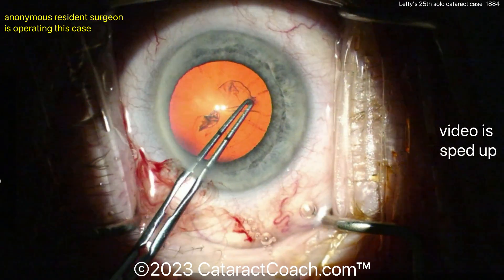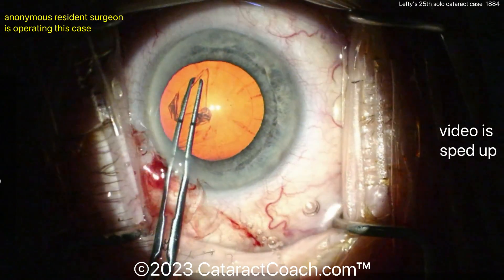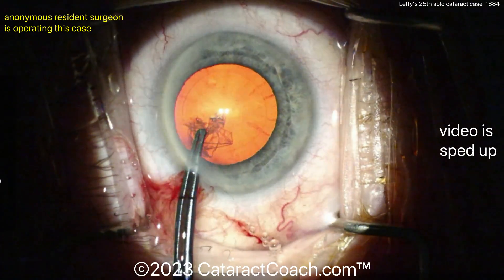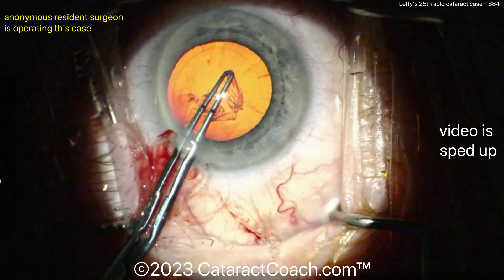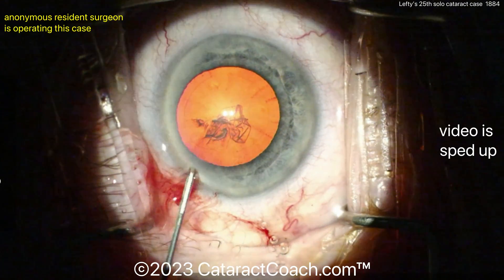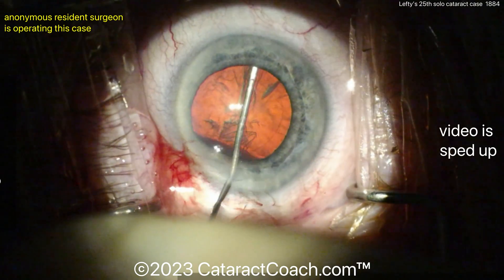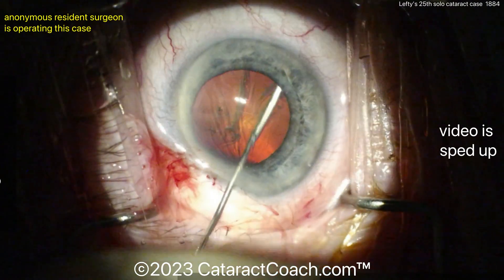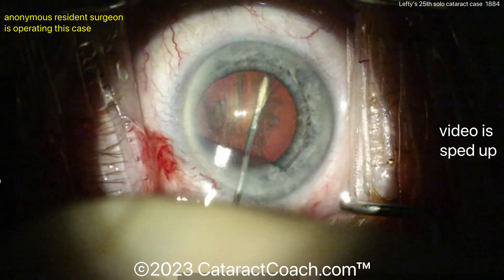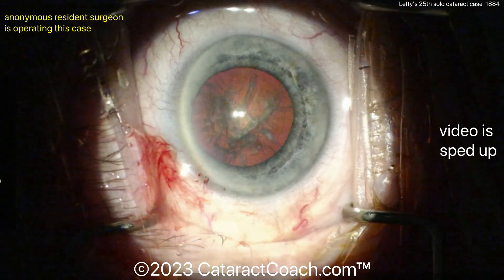Here's the capsule being done. I like the forceps that are marked off, similar to mine. This is pretty good for 25 cases in — that's a nice-looking rhexis. That is very good; I would have guessed this is at least a few hundred cases in. Fantastic job on that rhexis. Incision looking pretty good too. I like how the limbal vessels were barely nicked. Let's see the hydrodissection. I like to go to the sides instead of across, because across ends up pushing down and holding down the nucleus, and I don't want to exert any pressure against the posterior capsule. But that looks good — it looks like it's spinning pretty nicely.